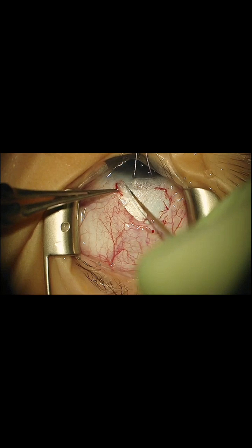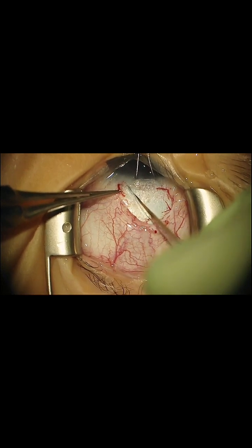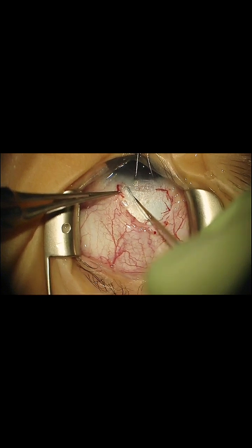And I'm being rather careful because this eye's really been stretched out, so I'm watching my depth as I do this.